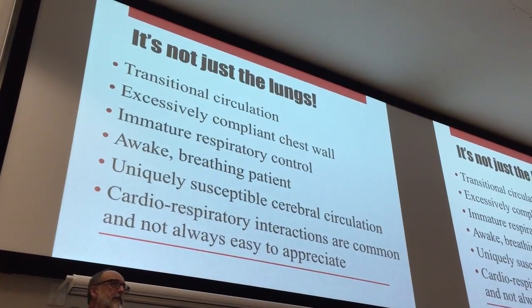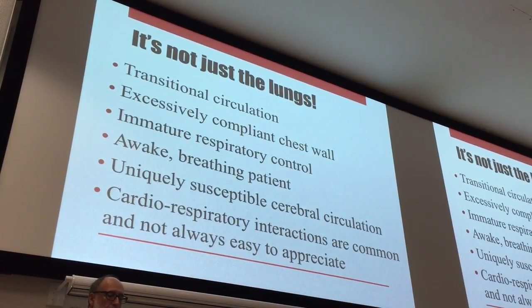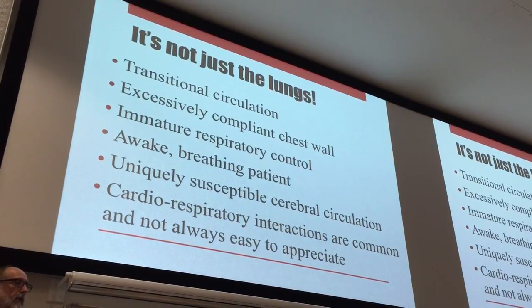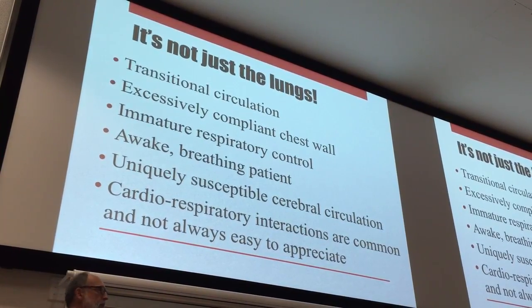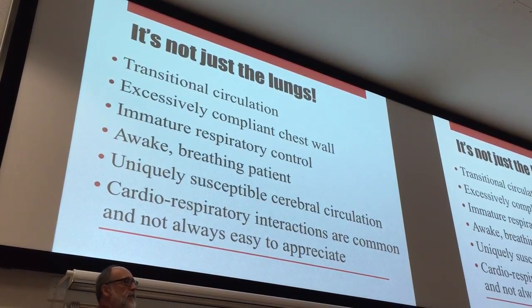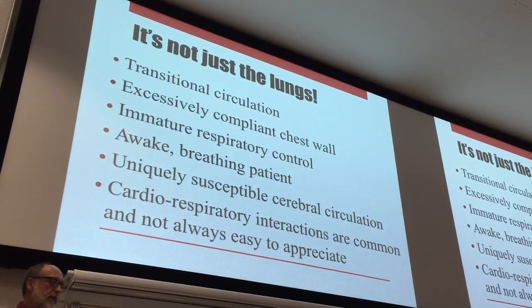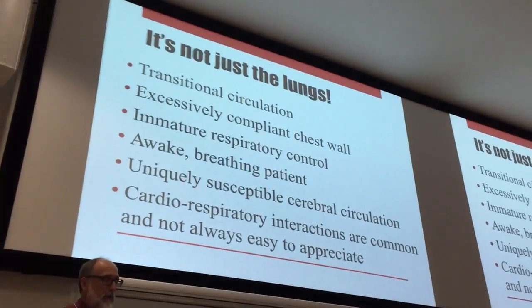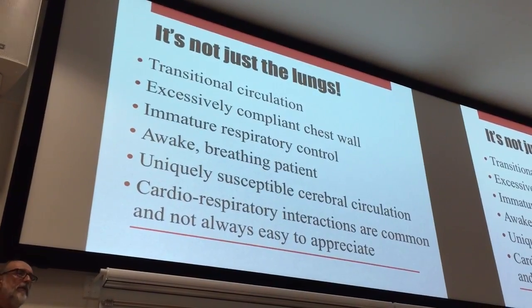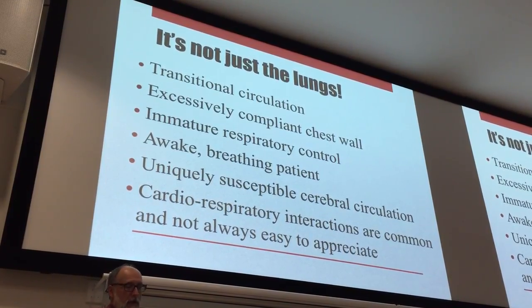And certain modalities that may be ideal for a little bit older babies may be a little bit problematic in very immature babies. And of course, we allow our babies to be awake and breathing, at least most of us do, because of some very good data suggesting that being too aggressive with sedation and paralysis makes matters worse. So we do this, but it does make life more difficult because of the way babies interact with the ventilator, they're always perturbing the equilibrium.